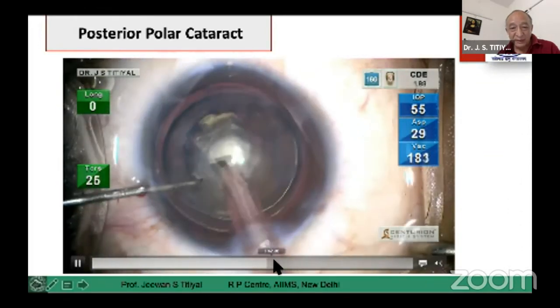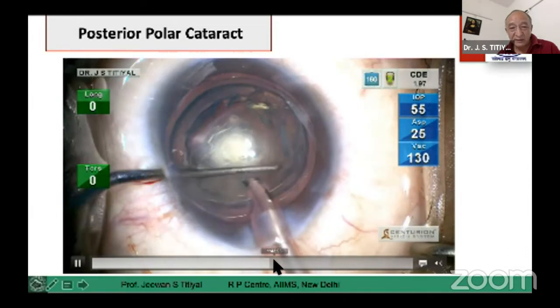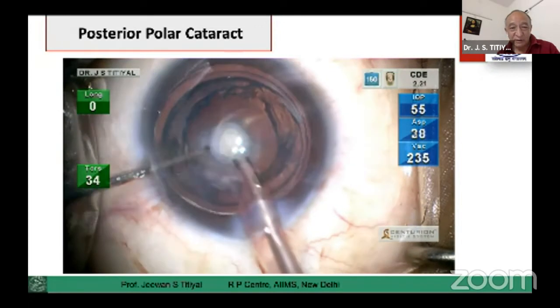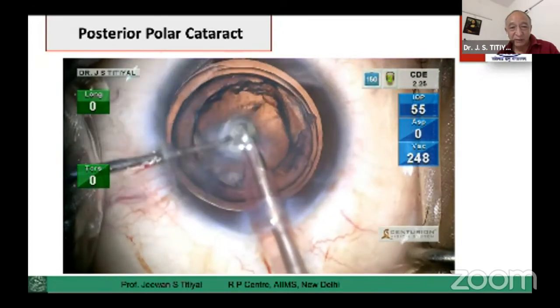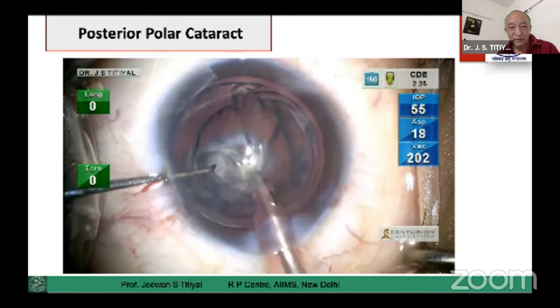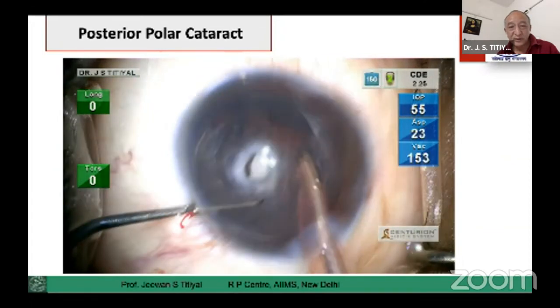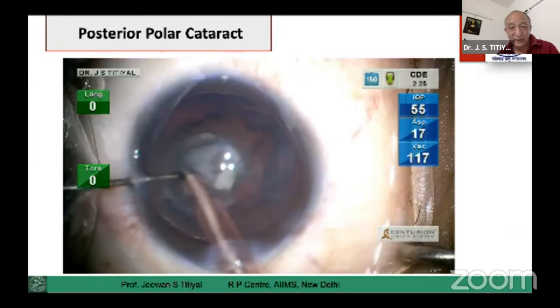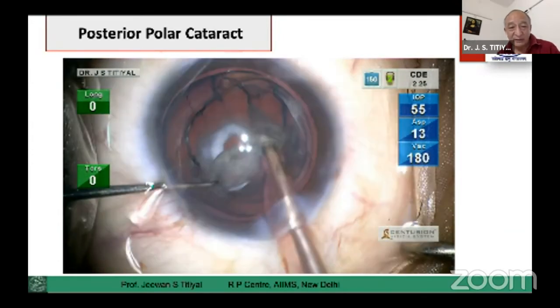Subsequently, we remove the central area. See — this nucleus is mobile but the epinucleus is still attached, and that is how it is going to save us. Now we are going to take out the first layer of epinucleus. This is the primary layer of epinucleus which comes out quite smoothly.